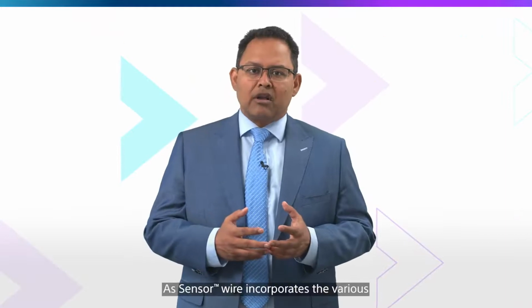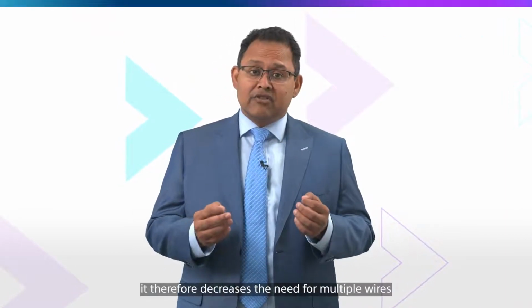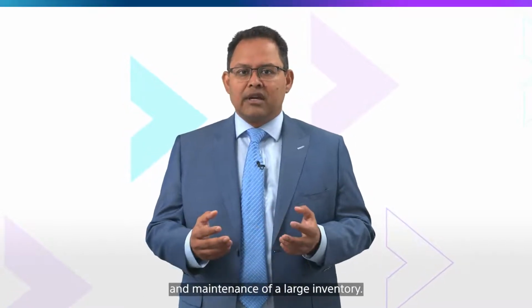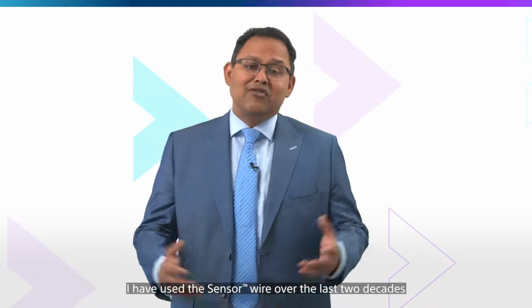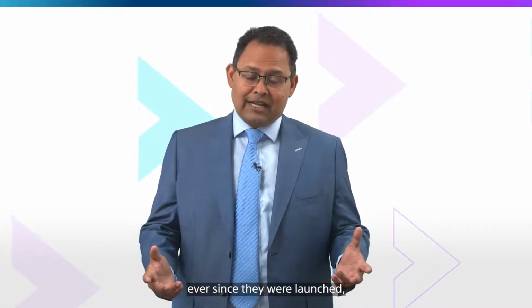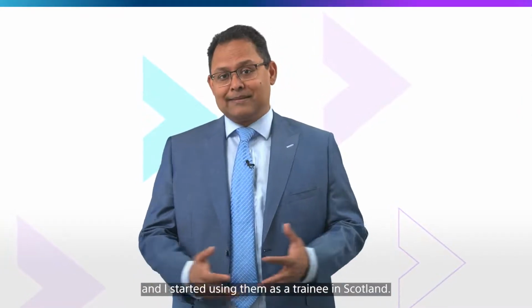As the sensor wire incorporates the various features of individual wires, it decreases the need for multiple wires and maintenance of a large inventory. I have used the sensor wire over the last 2 decades, ever since they were launched, and I started using them as a trainee in Scotland.